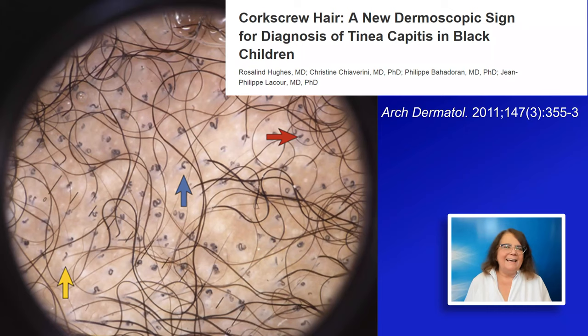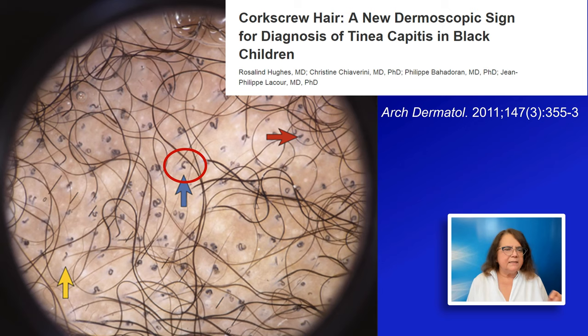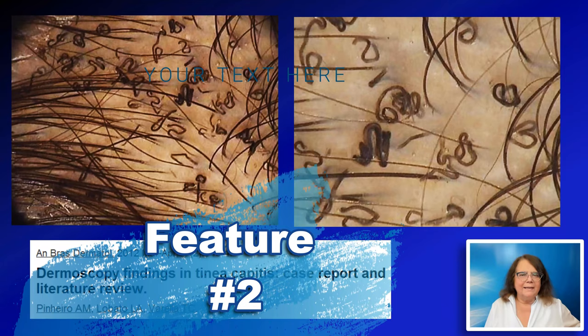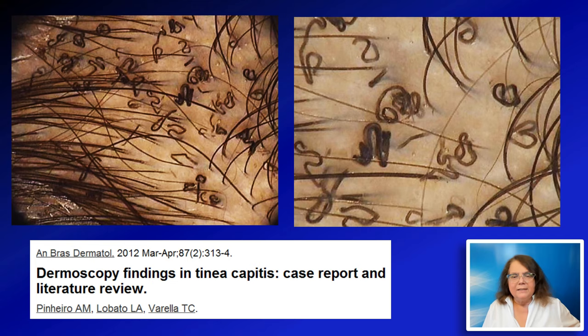Another trichoscopy feature of tinea capitis, described mainly in patients with dark skin phototypes, are the corkscrew hairs. These are comma hairs which tend to coil multiple times, forming a corkscrew-like structure. Here is an example published by Anna Maria Pinero and co-workers, showing multiple corkscrew hairs in a patient with tinea capitis.